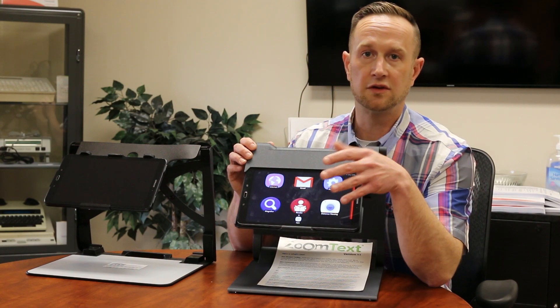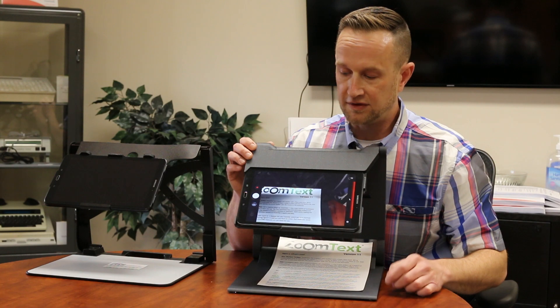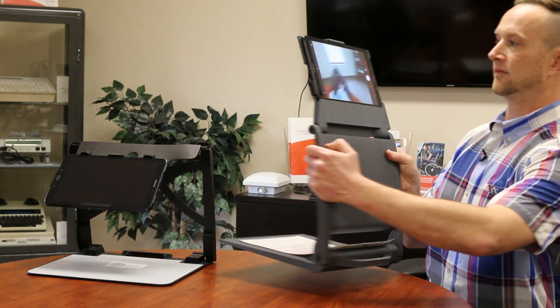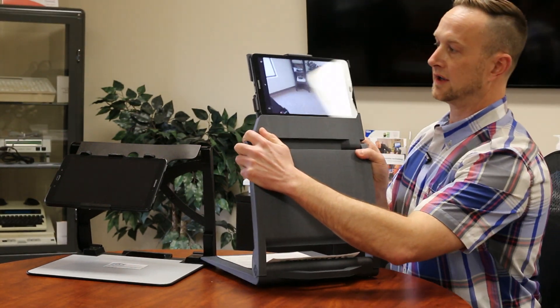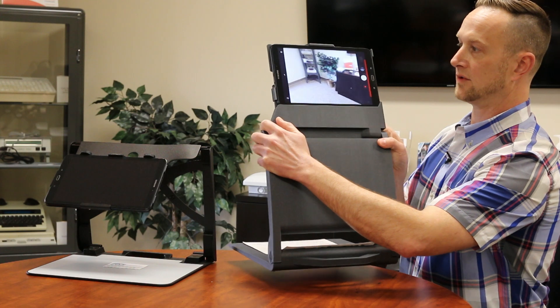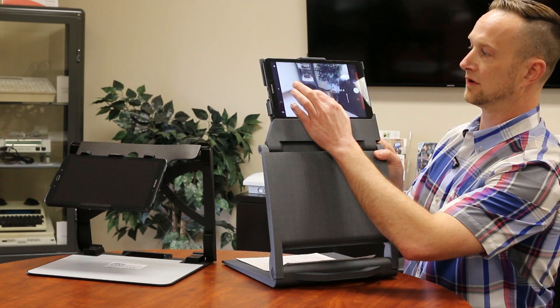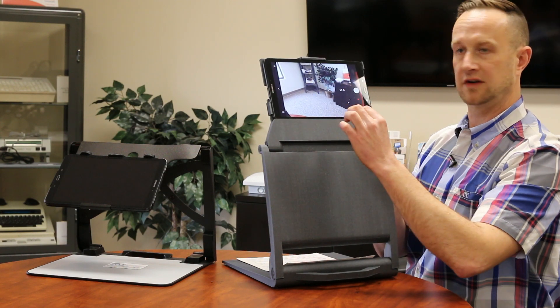If you're in a classroom setting or any type of setting where you want some distance magnification, all you have to do is hit the distance icon, turn this up, turn it around, and now you've got a nice distance magnifier as well. You can really turn this in any direction that you want, and even with the distance magnification on, you can still zoom in and zoom out.